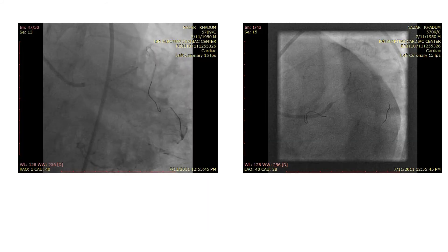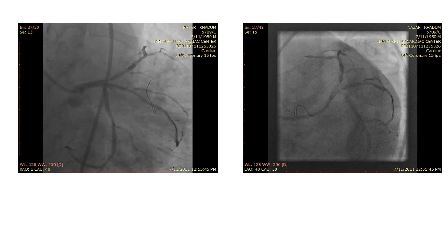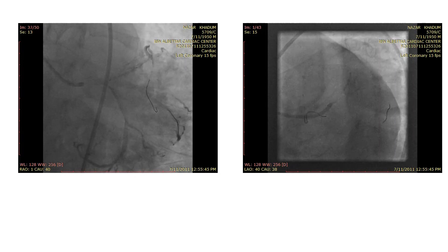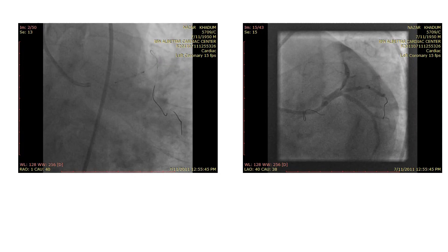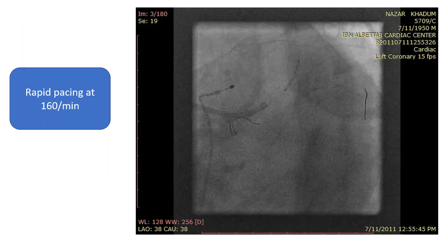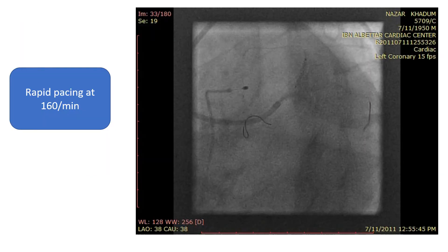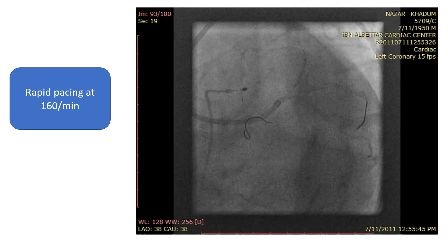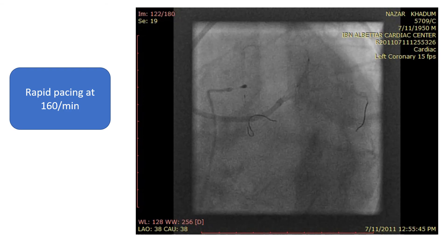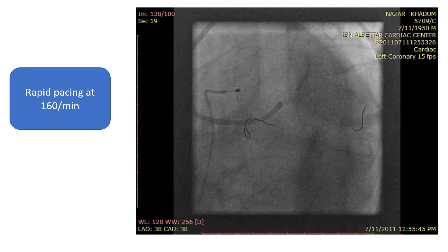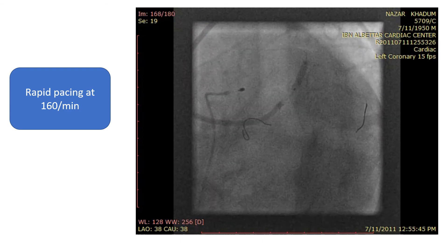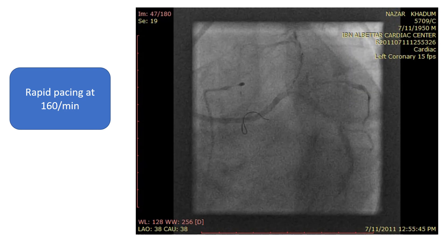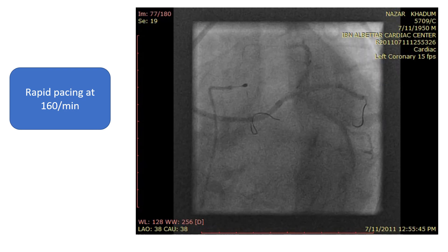If you push the stent, you will miss the ostium. If you pull it, you have to deploy it in the main stem. So we used rapid ventricular pacing at a rate of 160 per minute, and in that way we were able to immobilize the stent and deploy it at the right location at the ostium of the LAD.